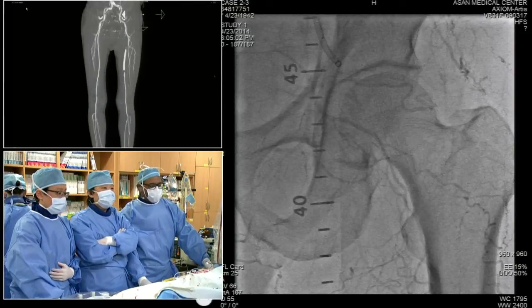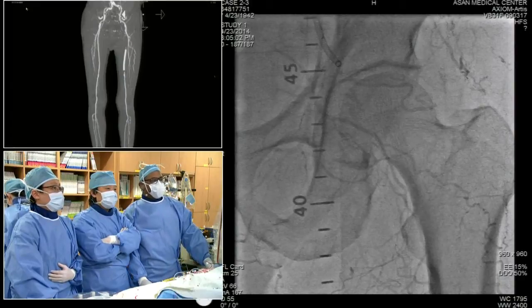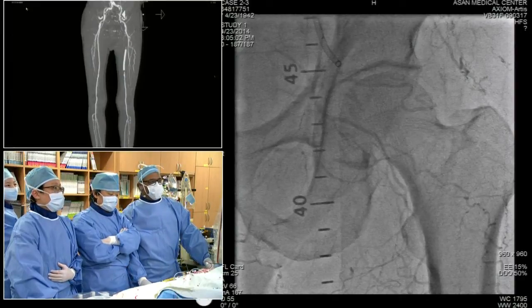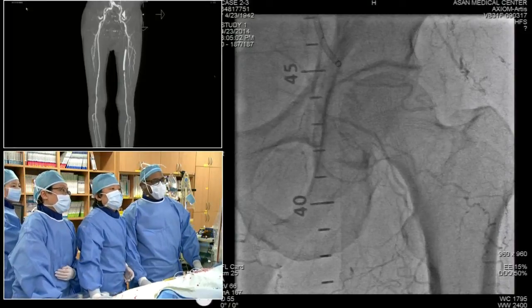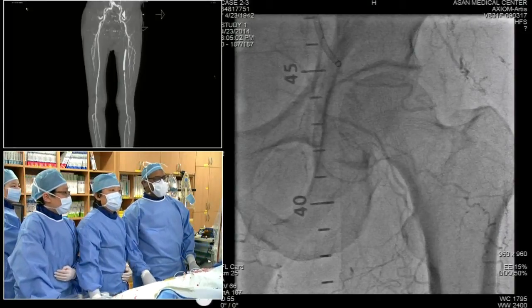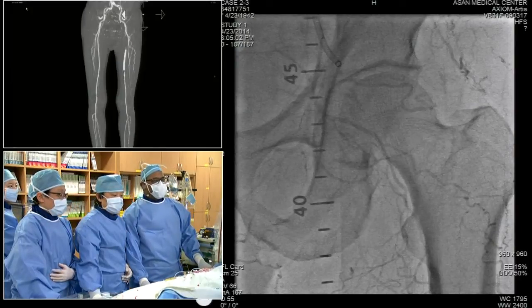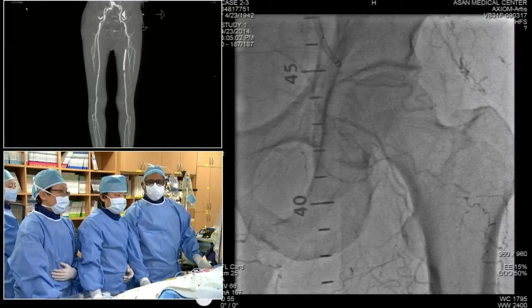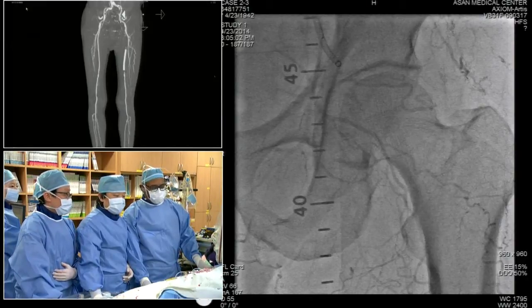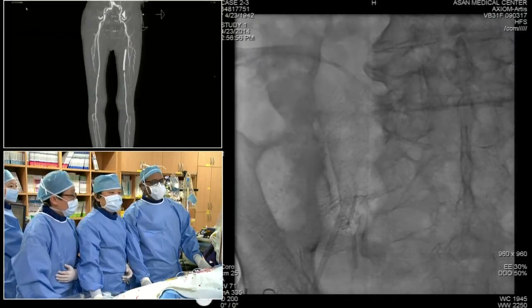Some of the challenges here that we're going to pursue: first of all, if we can go back through the first angiogram, we had a moderate amount of tortuosity that we had to navigate on the right side, the right external iliac. I don't know if we can loop the first shot. It was expertly crossed with a glide wire. I think on the way out we're probably going to have to stent this, since I suspect the patient will have some disruption. Here you see the picture.